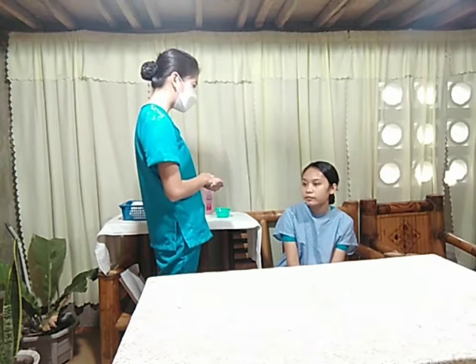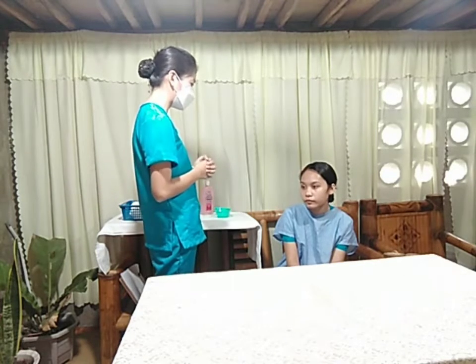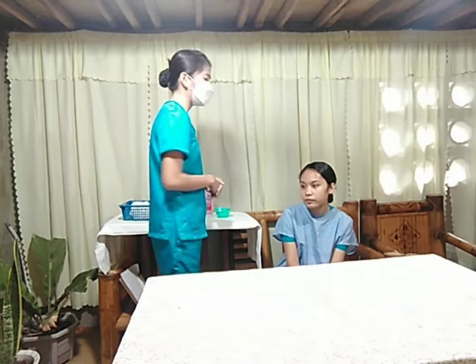So pero don't worry about this ma'am kay normal ra na siya while nag-administer, and later on mga pila ka minutes mawala ra pud na. Okay. So this helps the clients to anticipate about the experience of the procedure, and also para ma-reduce ang anxiety sa atong patient.